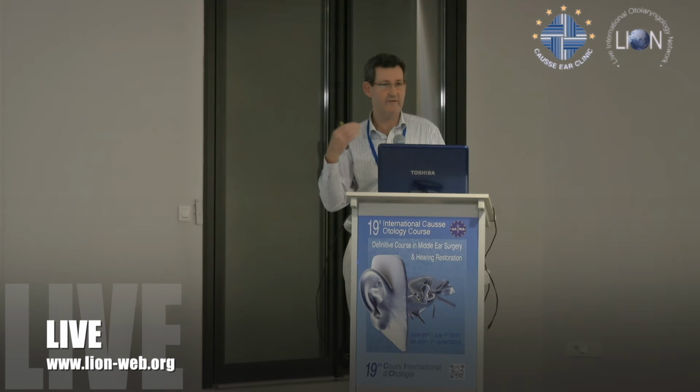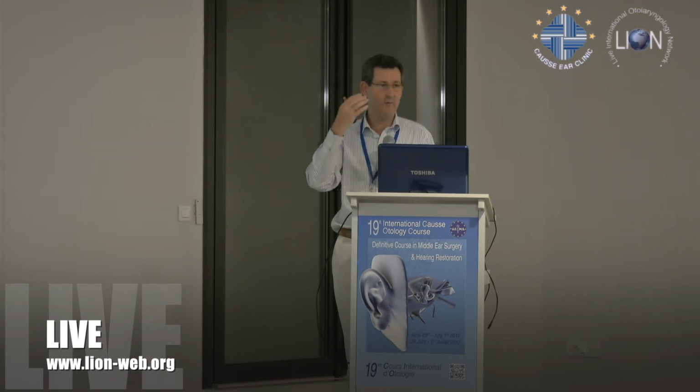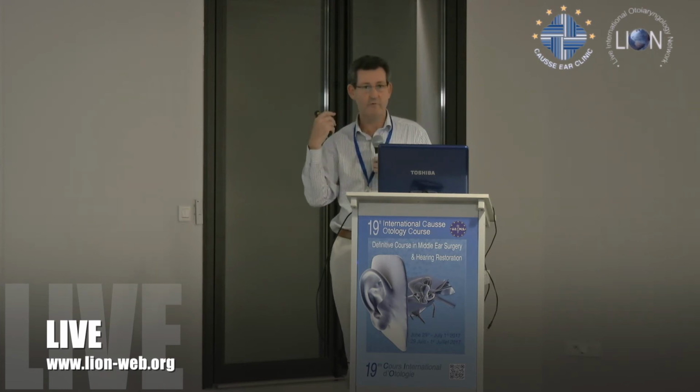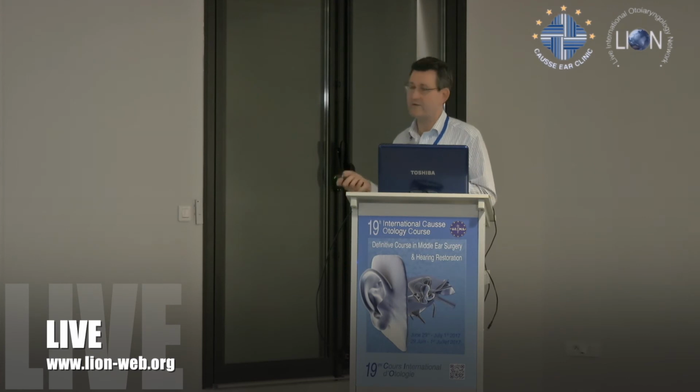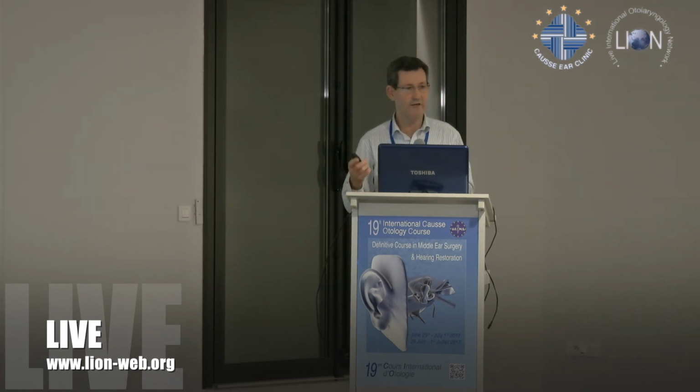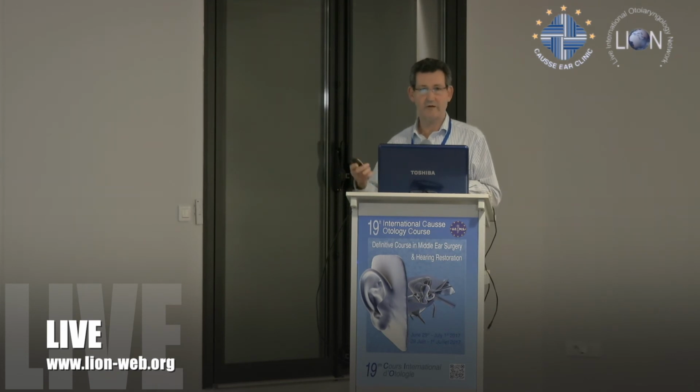And often I have patients where we're doing something to one or other ear, and you basically are taking their better ear out of action for a while, and they can't use air conduction, they can't use a hearing aid, but they need some temporary bone conduction. And this sort of device, I think, is very good for that, as well as simply trialling whether they like a Baha before going ahead with surgery.